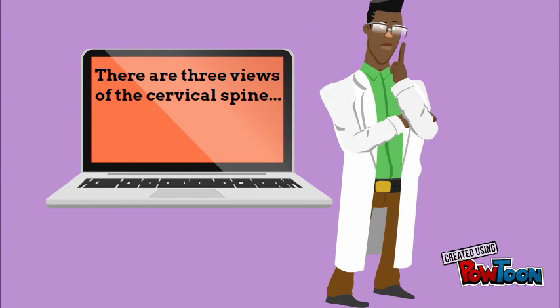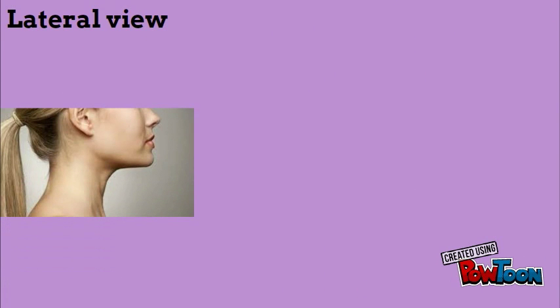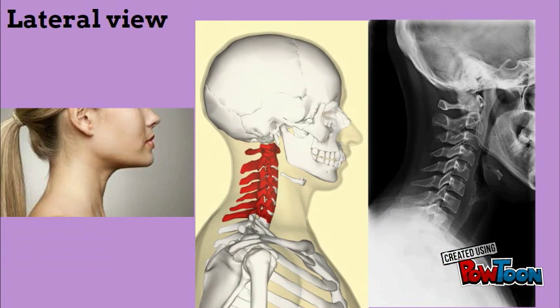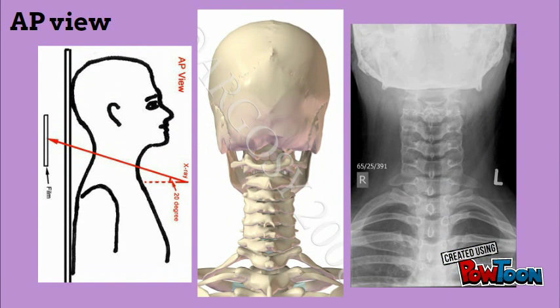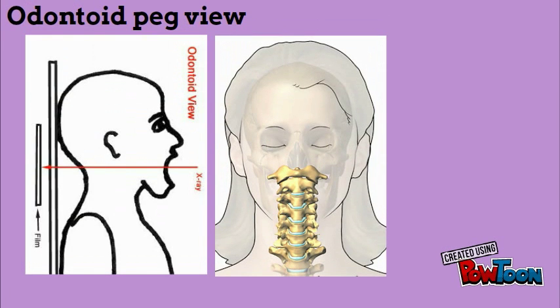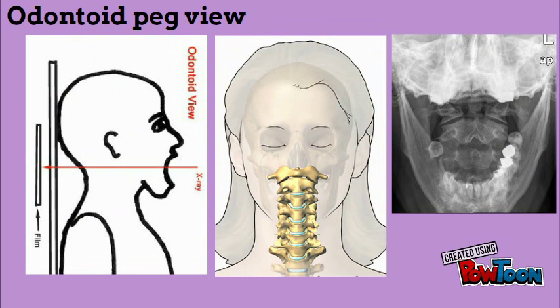There are 3 views of the cervical spine. Lateral view, AP view, odontoid peg view.